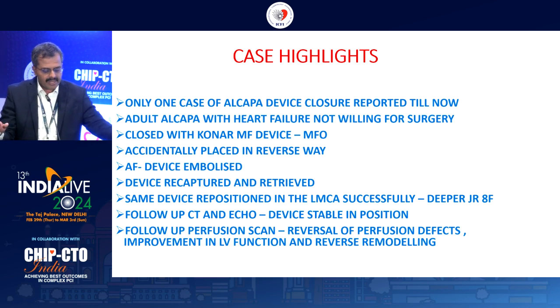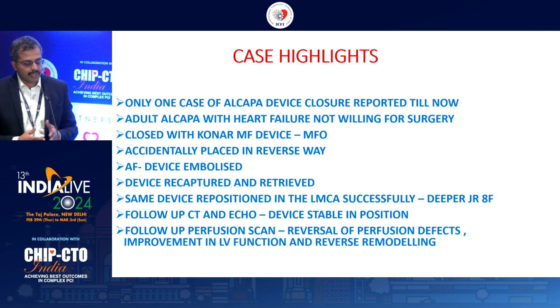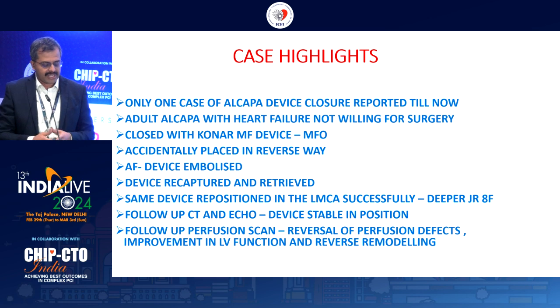Actually, he has found this device, and this device is very suitable. It can be deployed from either side. We had a device embolization which was recaptured and retrieved.